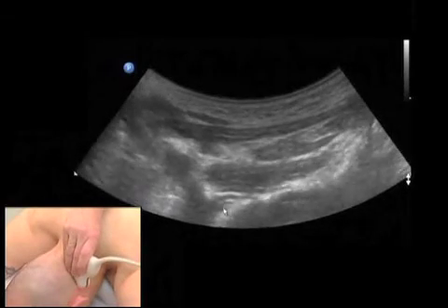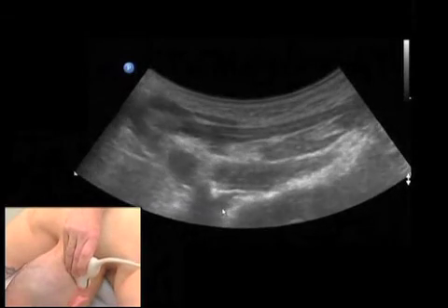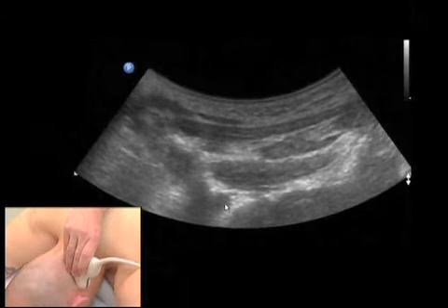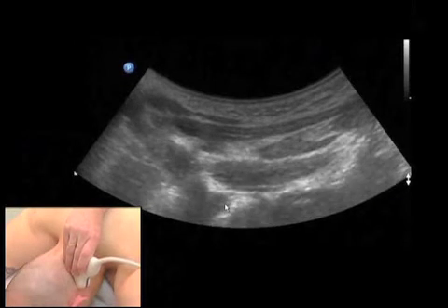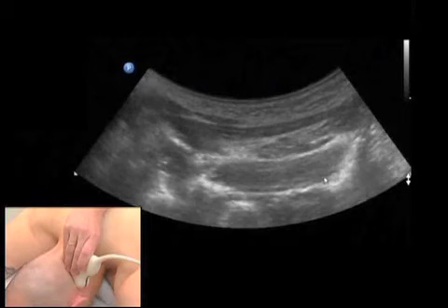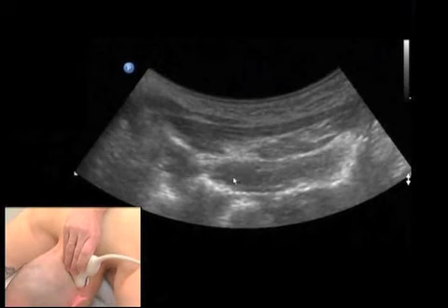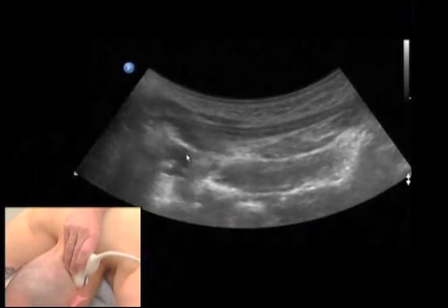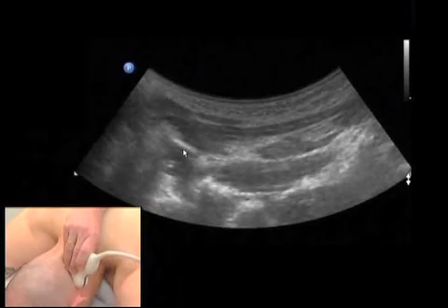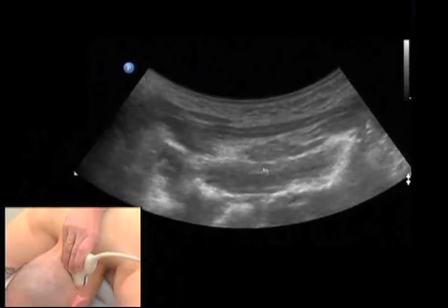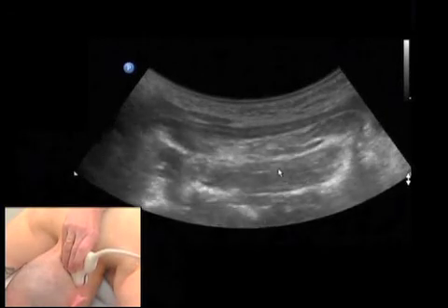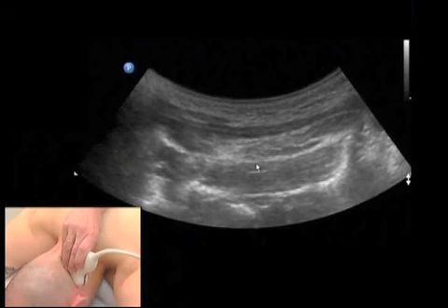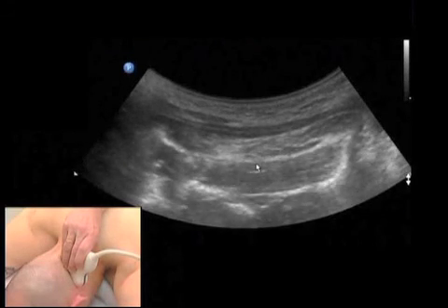Still lateral — if I move lateral, you get a good overview. You see the pulsation of the vertebral artery. So the big advantage of a curvilinear transducer is to have the whole overview until the lateral end, which is the transverse process of atlas. And the greater occipital nerve is still seen on top of this muscle.